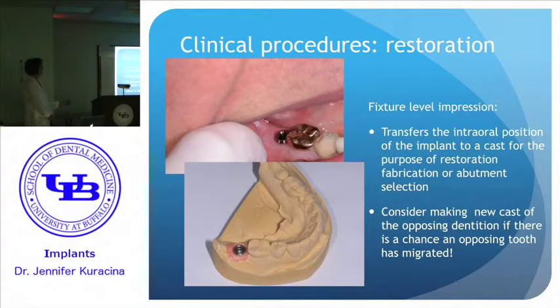They can obtain a catalog from the dispensary, or they can use my little condensed list, and Deb brought copies of those up here, but these are down with all the dental assistants in their stations. And so they'll need some assistance to fill out their order form, and we would sign it. So they'll need initially a fixture level impression coping and an implant replica.